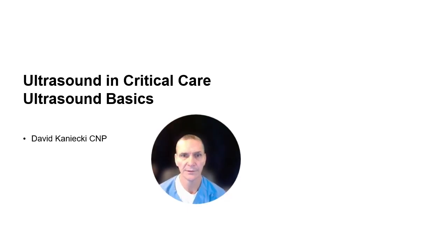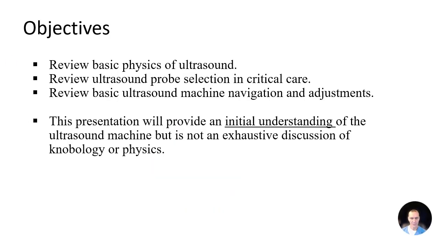Ultrasound is a widely used imaging technique that provides real-time visualization. Its popularity in the ICU for critical care diagnosis and management is increasing. This presentation aims to give you a basic understanding of how it works and equip you with the skills to effectively use the machine. The objectives of the presentation are pretty straightforward.